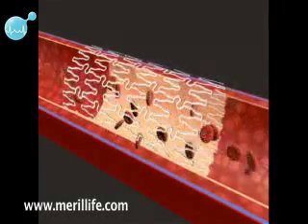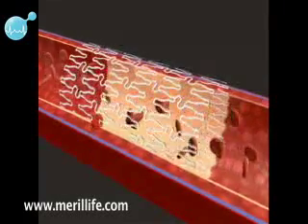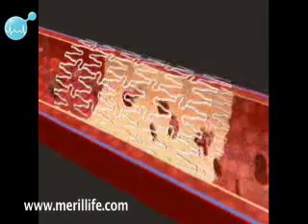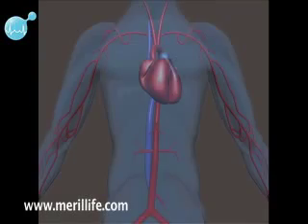So this is how angioplasty enables proper blood flow through the artery, restoring the circulation to the heart.